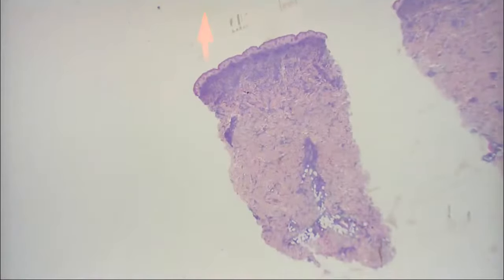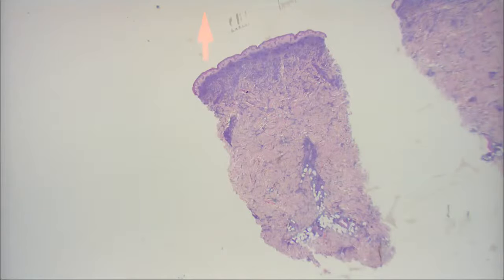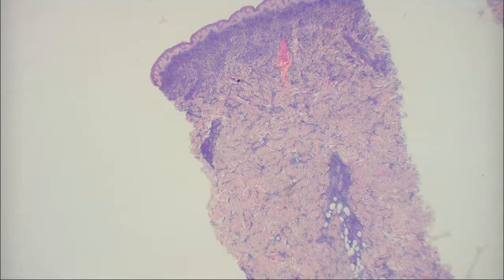This one is a punch biopsy. Good. And just looking at it, you can see that there's some kind of cells. What sort of cells are these? Lymphocytes. But they're not as small and as dark as classic lymphocytes like we saw in the one a minute ago, are they? No. These are abnormal. They have more cytoplasm. You can see that at low power.